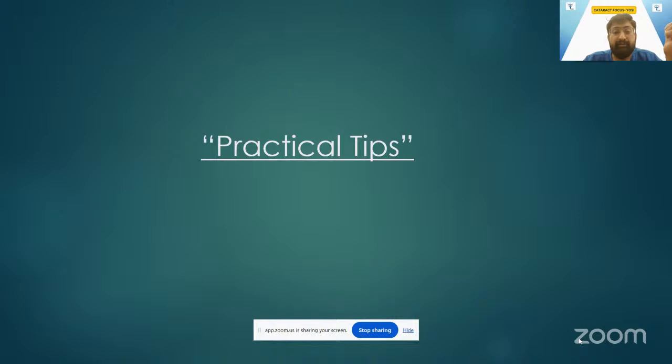Along with this, a too short side port, or a too steep side port, or a wrongly placed side port towards the corneal side or towards the scleral side, can eventually mess up with the iris as well. So this is the practical tip which is related to the same.